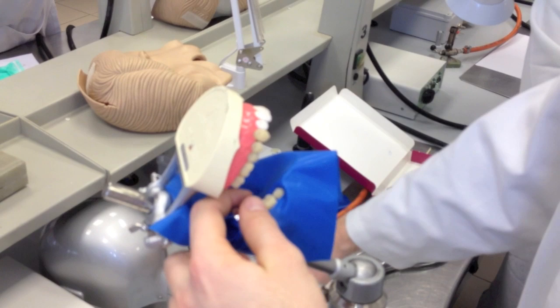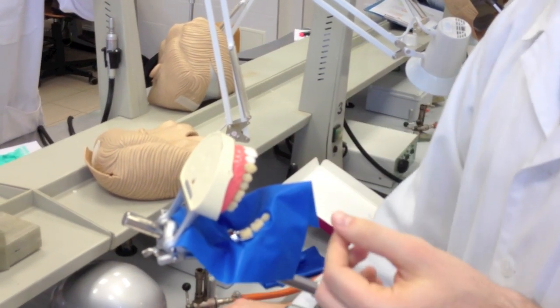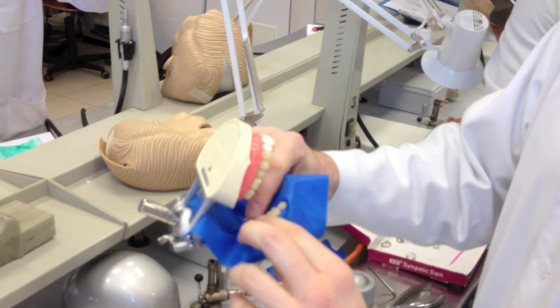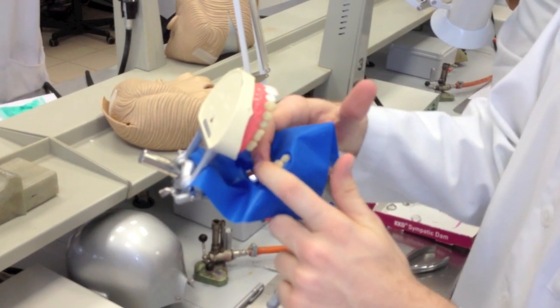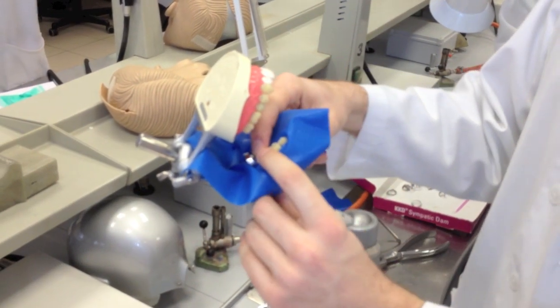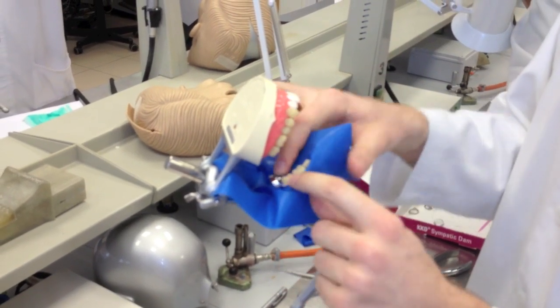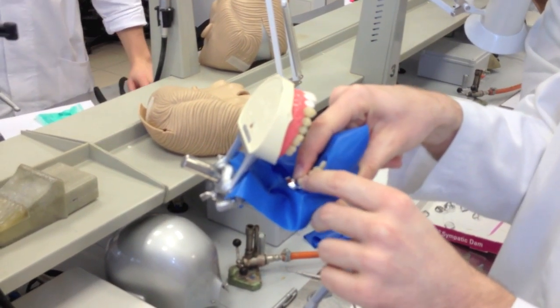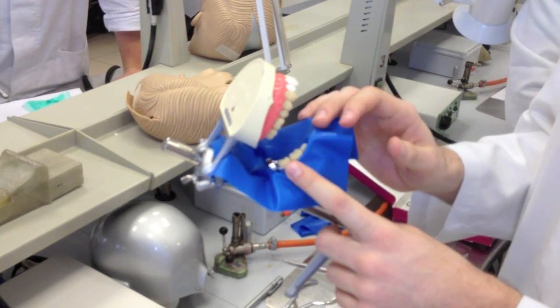Another important thing: the patient, the dentist, and the assistant should wear eye protection during the process, because sometimes it can happen that there's some problem with the tooth shape — it's too tapered, or the clamp is not the best. If it jumps off, be sure that you don't damage yourself. Always check with your hands if it fits. If it's moving or loosened, then replace it for another one.